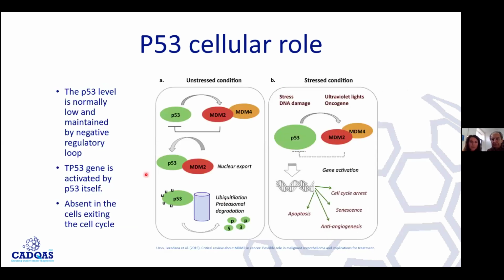And this is to show how P53 regulates its own level of protein in normal cells, which should be low. We see that by immunohistochemistry, and I'm going to show in a minute, it's usually weak to moderate expression and is either scattered around or it has some sort of gradient according to the stratification. We see that in epithelium, don't we? The position of the cells in an epithelium, yeah.